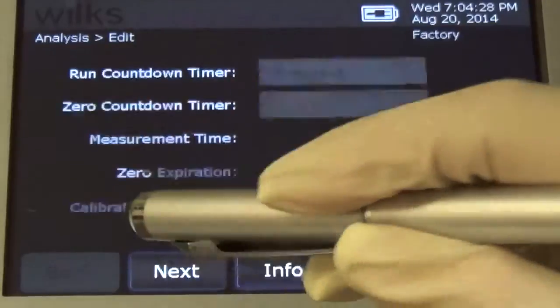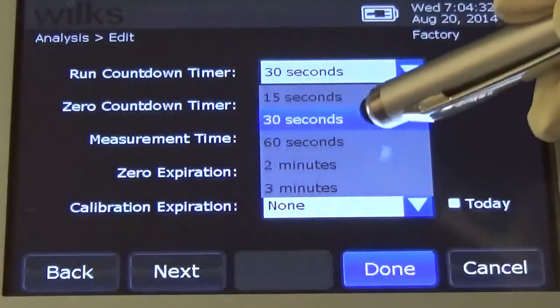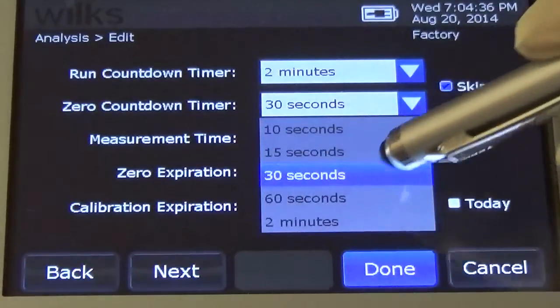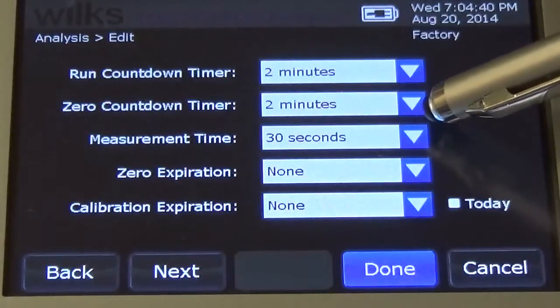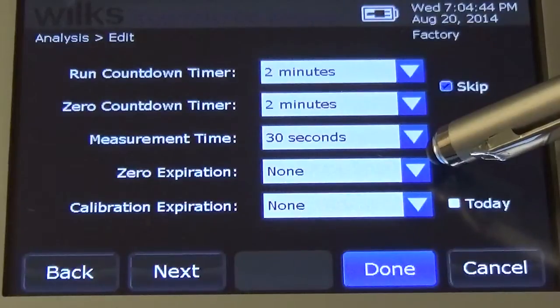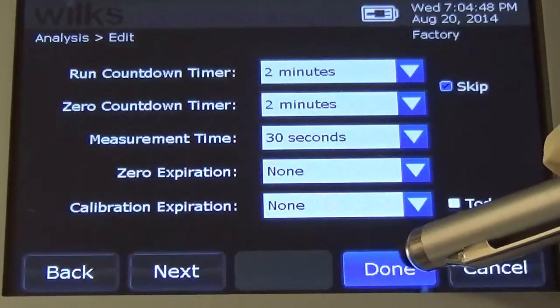Select Next. Set the Run Countdown Timer to 2 minutes. Set the Zero Countdown Timer to 2 minutes. Set the Measurement Time to 30 seconds. The Zero and Calibration Expiration Times are optional. Select Done.